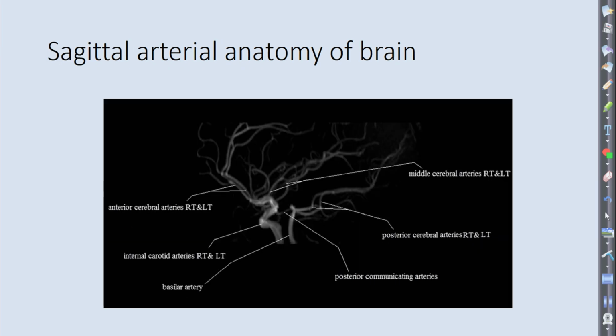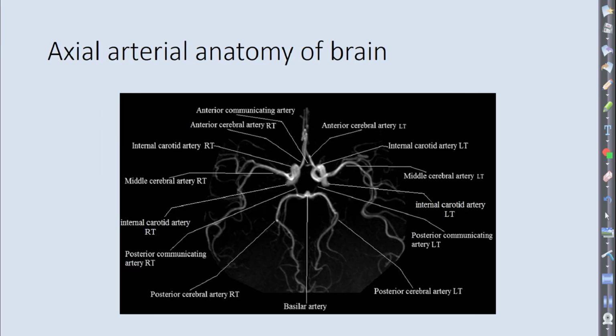So I supplied different views. So this is your coronal, and here's your sagittal. Okay. Really highlight this slide. You're gonna know one view. Know your axial.